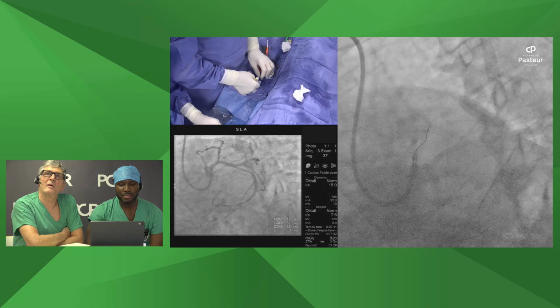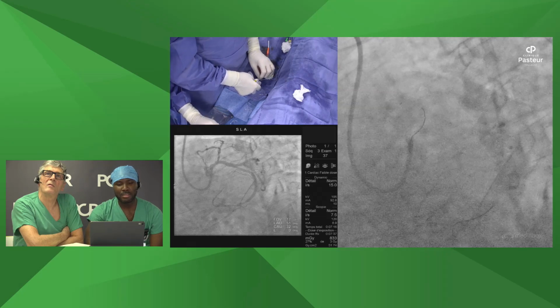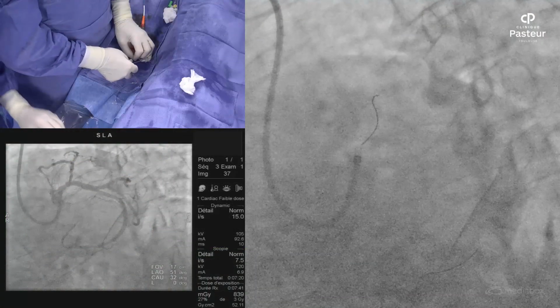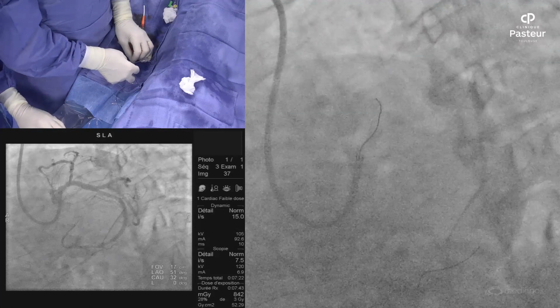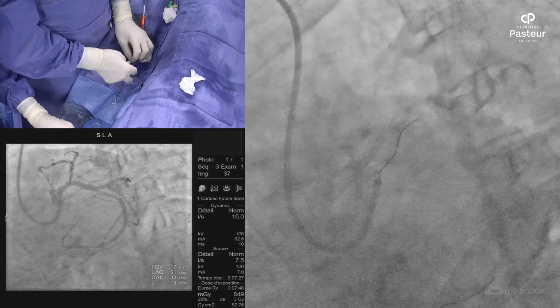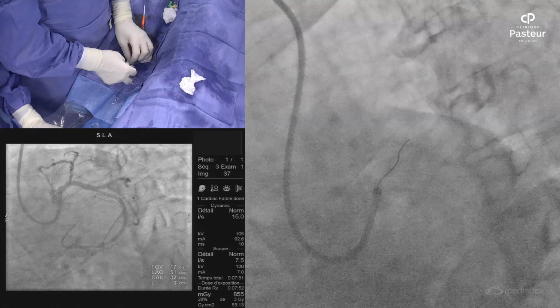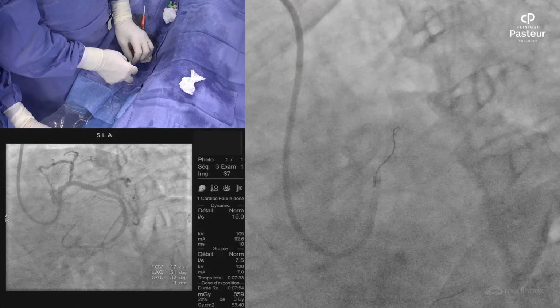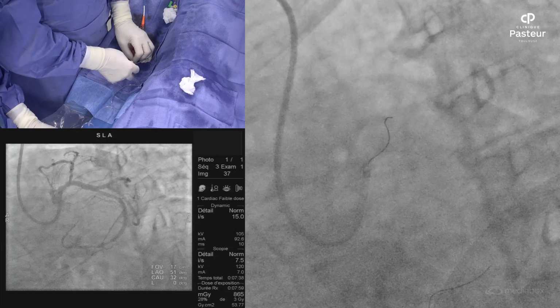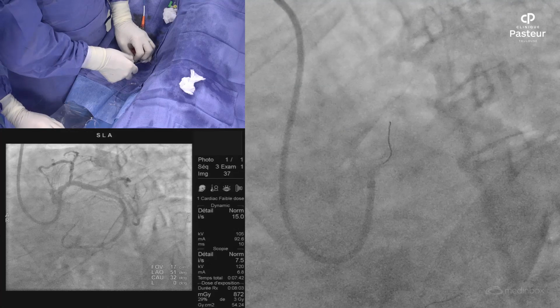Maybe not. I have the impression that I am in the lateral. Ah no, it's okay. So I was thinking that I was in the lateral. Maybe we can move in the artery, and I now think we have to avoid the diagonal. There is a lot of feeling of resistance, of calcifications. That's why it's important, something mentioned by Thierry from the beginning, that there was some calcification. Not easy to advance. We will try, but we will see.